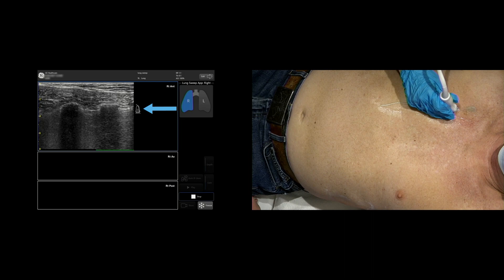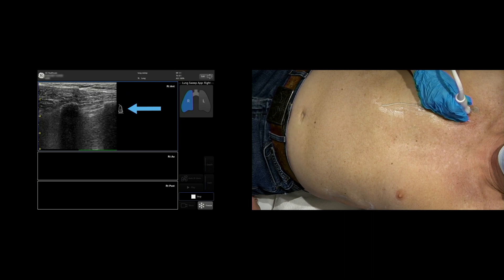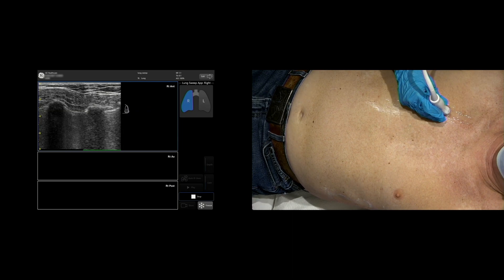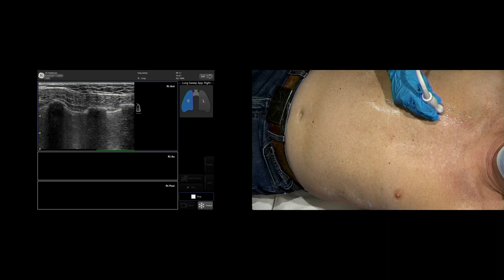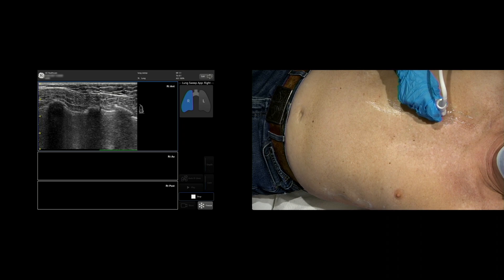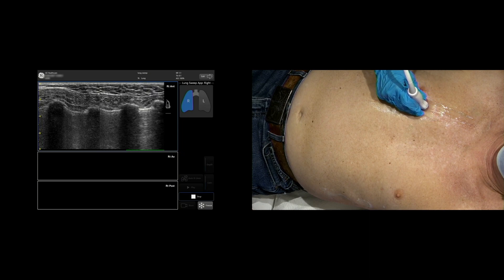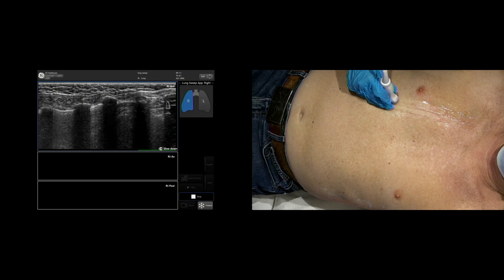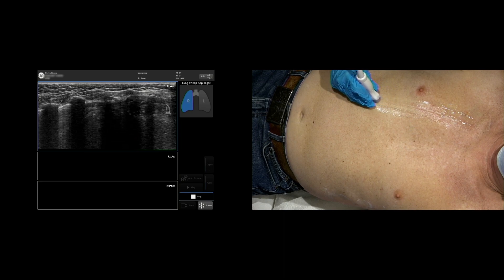Just like Venue View, you can back up the scan to re-image an area to improve your sweep. During scanning, the system may display messages such as 'improve probe contact' or 'slow down.' Adjust probe contact and speed of scan to optimize the lung sweep.